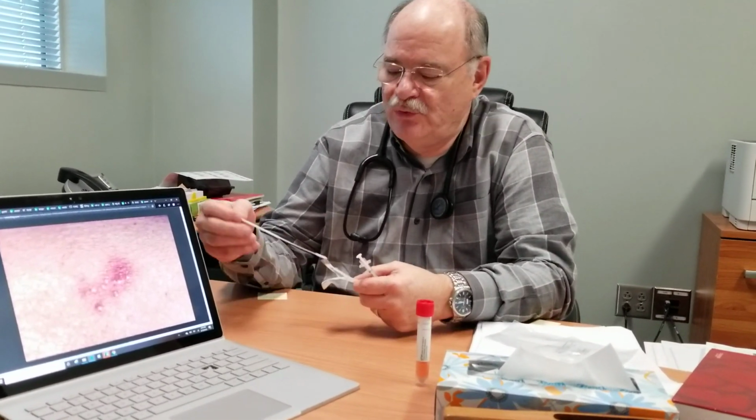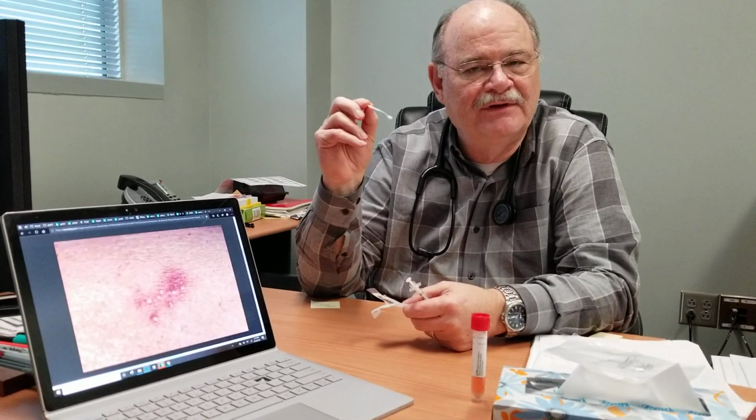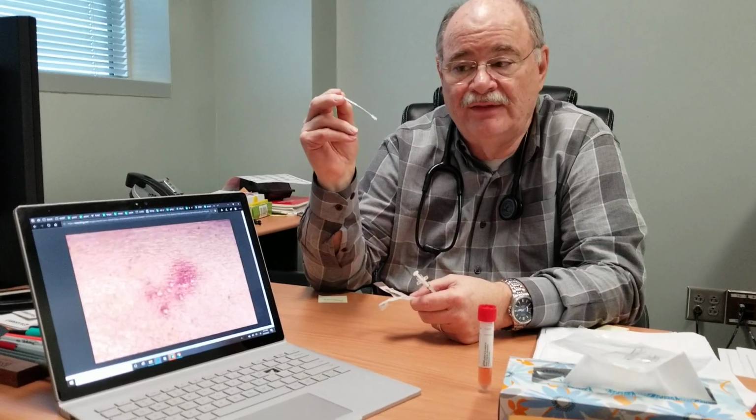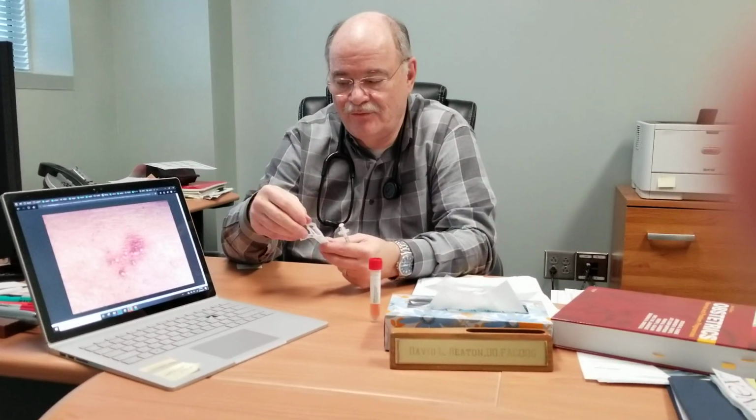So classically, when you think someone has herpes, you're taught that you're supposed to use a swab similar to this, and you're basically supposed to rub the top of the vesicle and rupture it, and then collect the fluid on this, and then place it in the media to actually get the culture performed.